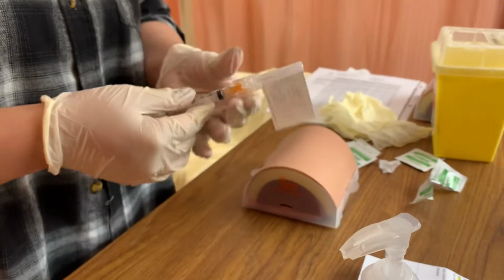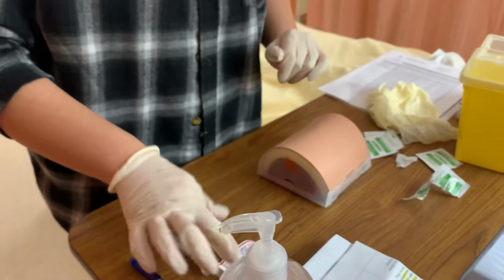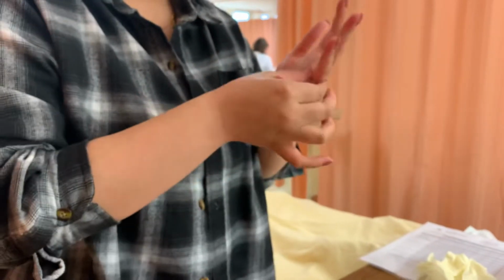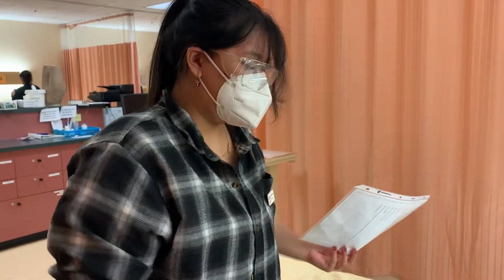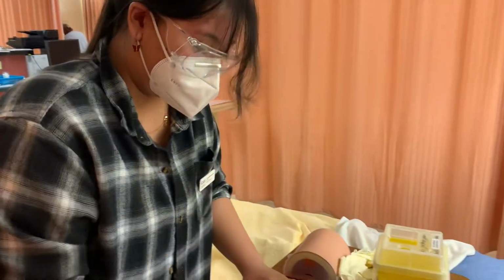So after I do that, I will actually throw this out in the sharps container, but for demo purposes, I will be using it again later. So I have removed it. I'm going to remove my gloves. I'm gonna throw it out. I'm gonna wash my hands. Okay. So if you feel any fatigue, or if you feel like you are bleeding anywhere, make sure you notify the nurse after giving this medication.